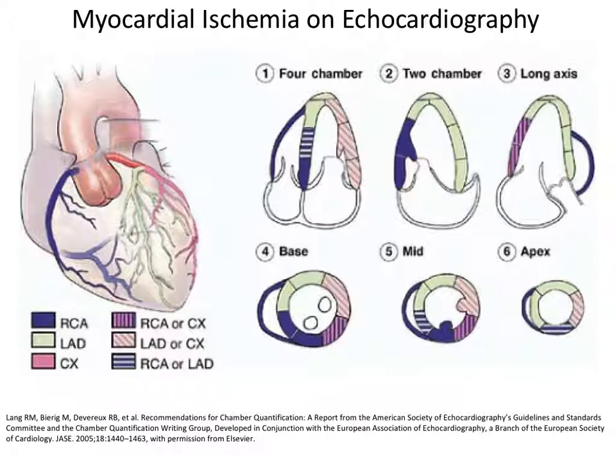When you're playing baseball, and you don't want the ball to go in the swimming pool, what do you put there? A net. Big net, right? So let's put in a catheter that has some kind of parachute net that's distal or downstream from where you're going to do all your action. And then if you drop it or it comes off, it'll get caught in the net, right? And then you go over to the net and try and pick it up, right?